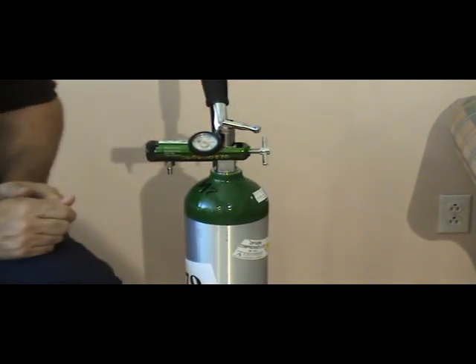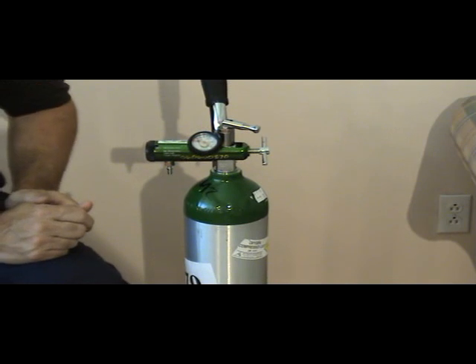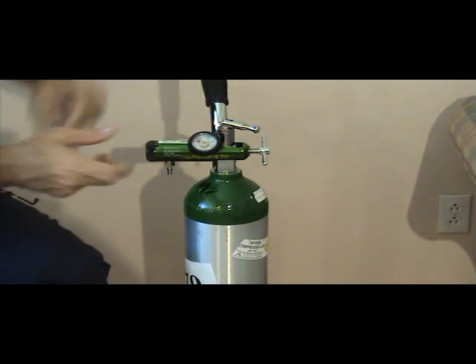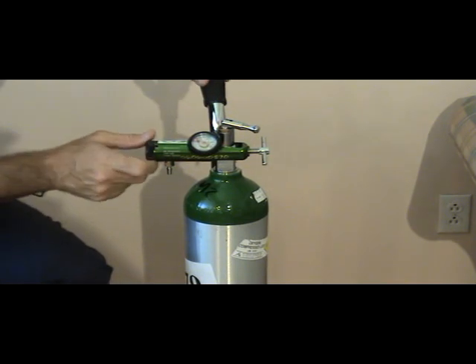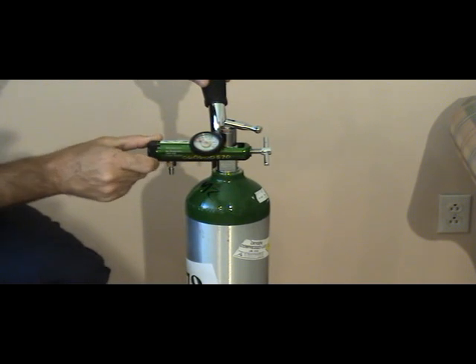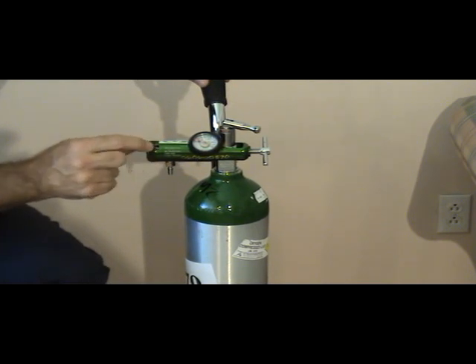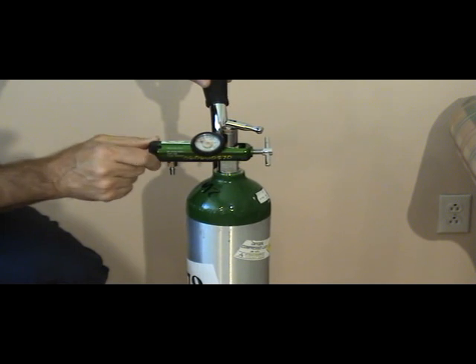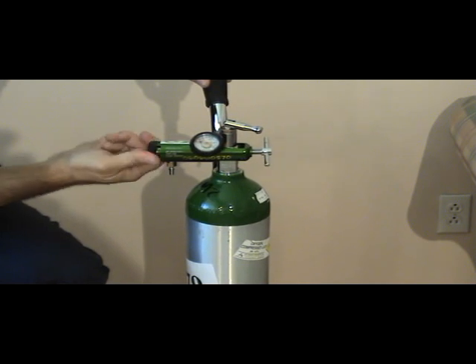So the first thing we're going to do is check to make sure there are no leaks. In order to do that, right here on the side there is a little knob, and you can turn that and that will set the flow. If you look at this little hole right here, you'll see that right now it's set at 2, 1.5, 1. It goes anywhere from 1/2 all the way to 8 liters per minute.